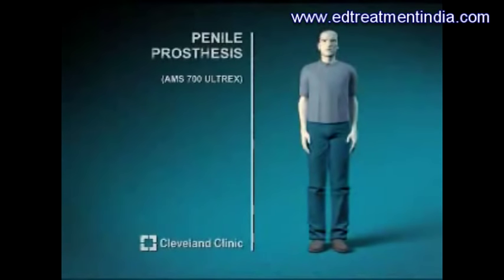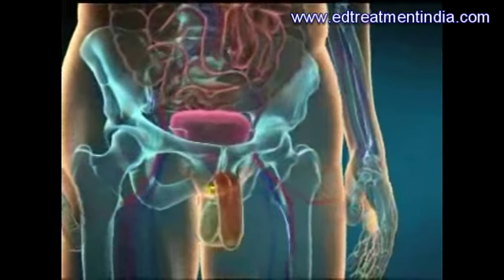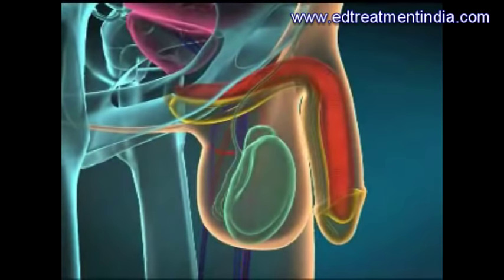Penile prosthesis implantation is often done when medical treatment for erectile dysfunction fails. Today's penile prostheses are fluid-filled inflatable devices consisting of paired penile cylinders, a scrotal pump, and an abdominal fluid reservoir.